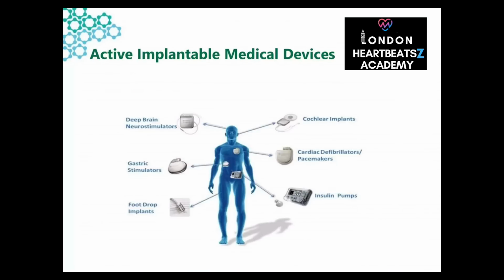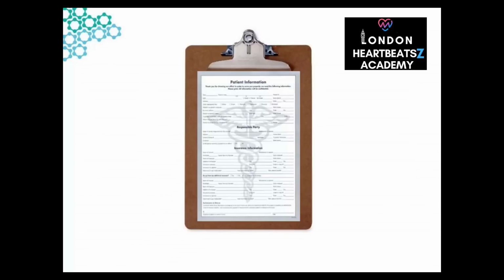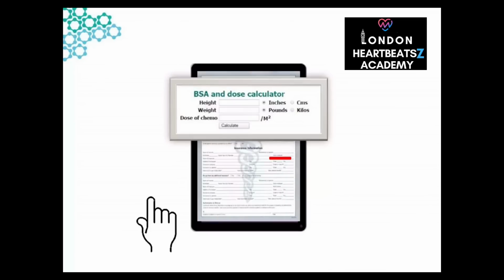So how do we figure out if some software falls under these regulations? What questions should developers be asking? Well, there's a qualification checklist you can go through. The first thing: is the software intended to be used for individual patients? That helps distinguish it from software for research or population health management. Second, does the software perform a medical action? That could be diagnosing, monitoring vital signs, or providing treatment recommendations. So even a meditation app that analyzes your heart rate variability could potentially fall under this. It could, if it's making claims about your health.